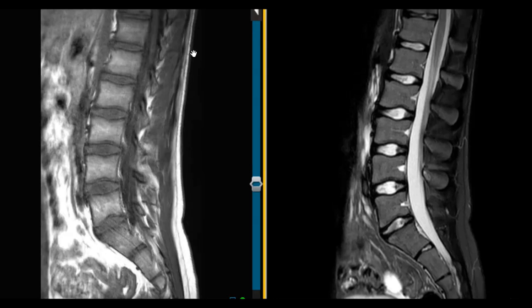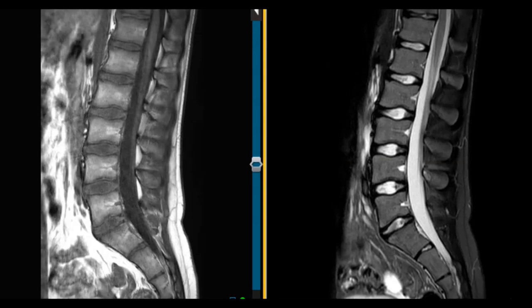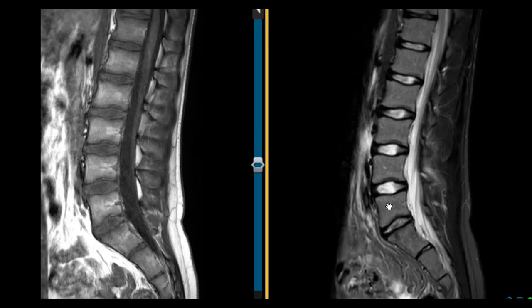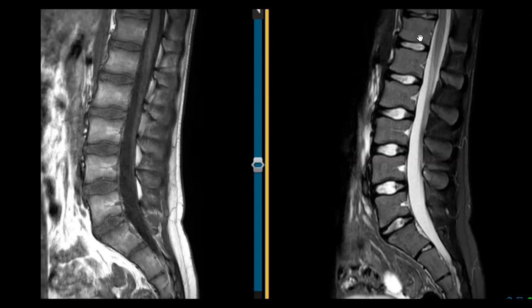On the MRI scan here, we see two sagittal views looking in profile. We see the vertebral bodies — these squares, the bones — and in between we see these cushions, which are the intervertebral discs. The discs look very healthy here; they're very bright on this view, and the bones are nice and dark, which means they're normal and healthy.